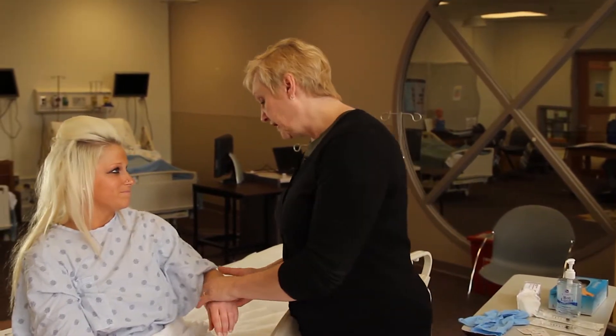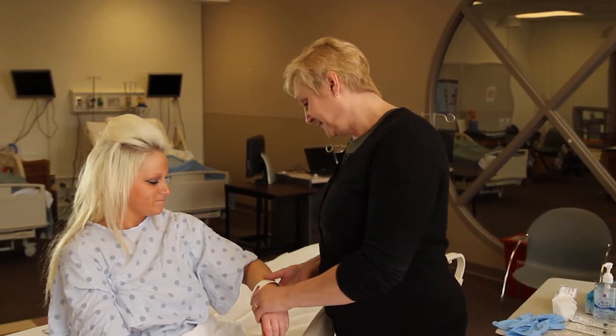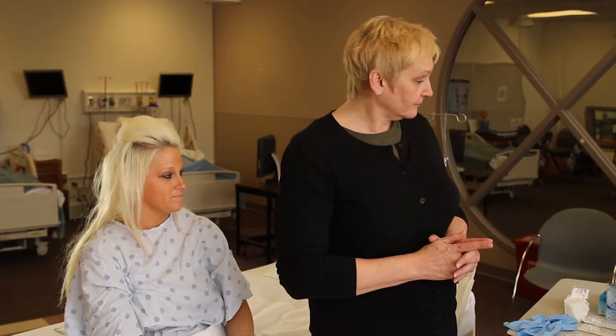Check the patient's identification band. Verify their identity by asking for their name and birth date.